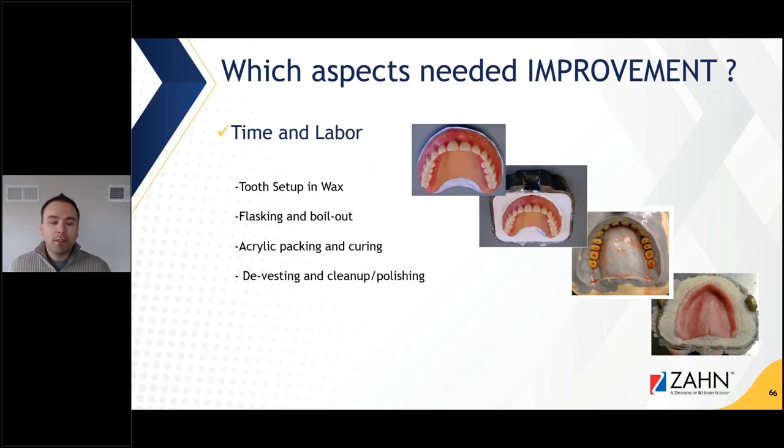Why? We have things like tooth setup and wax. We have flasking and boil out, acrylic packing and curing, devesting, cleanup and polishing. So even though some of the more skilled denture technicians might say, oh, but I do my setup in 30 minutes only, or 40 minutes only, and I can pack real quick, these are very labor intensive, very messy processes that are simply baked into the production of the denture.